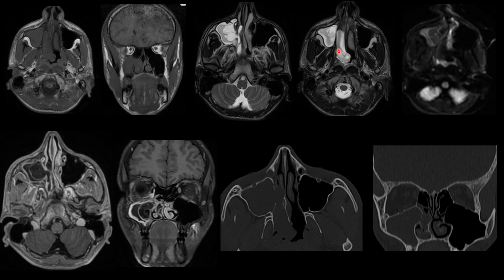There is no DWI restriction. On post-contrast imaging, we are seeing peripheral enhancement of the lesion. There is no central enhancement or any other abnormal nodular enhancing lesions.